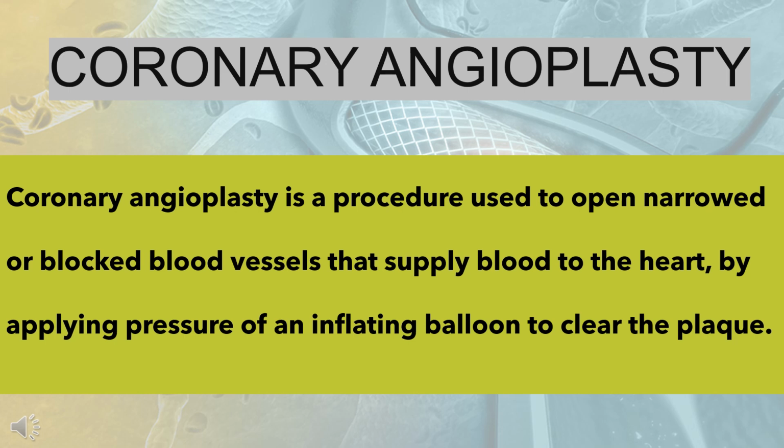Coronary angioplasty is a procedure used to open narrowed or blocked blood vessels that supply blood to the heart by applying pressure of an inflating balloon to clear the plaque.